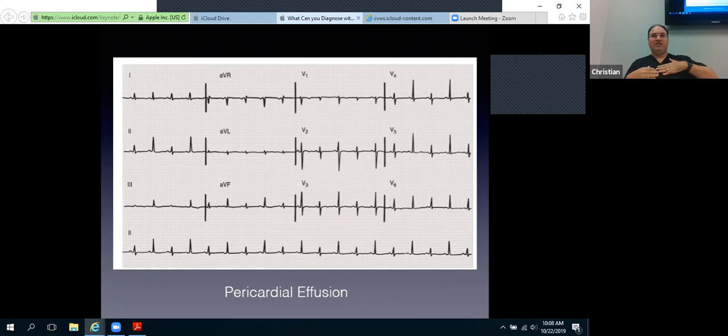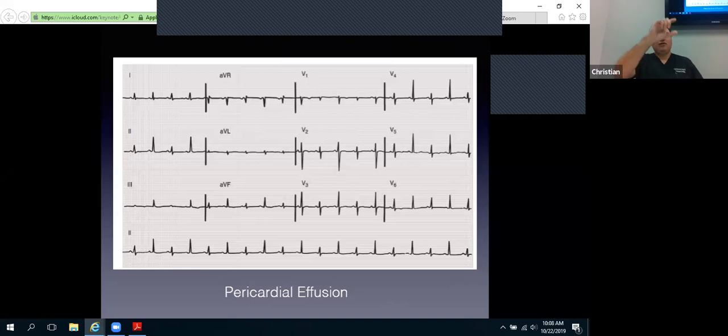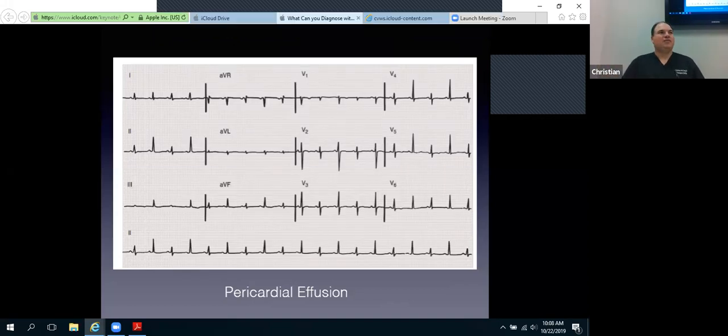These are surface electrodes, so as you move closer to an electrode, you get higher amplitude, and further away from the electrode, lower amplitude. So somebody who has COPD has an inflated chest, right? They're barrel-chested. So their heart is further from the chest surface, giving lower amplitudes. So without seeing a patient, I can look at that and say, oh, this person probably has COPD because they have low voltage all the way throughout. Or you bring me somebody with really huge R waves, and I'm looking at a 10-year-old EKG. I'm like, oh, okay, skinny 10-year-old, the heart is right there. So big amplitudes.